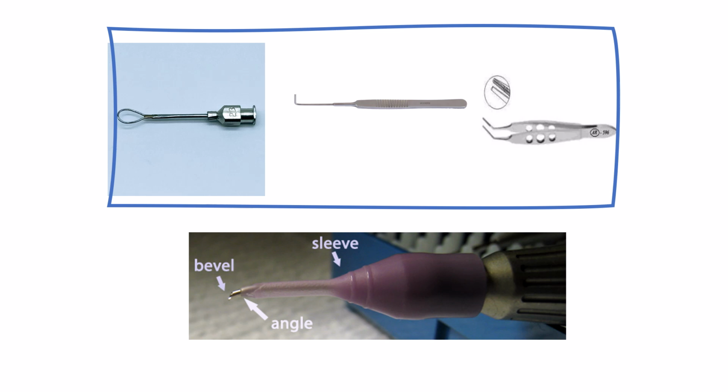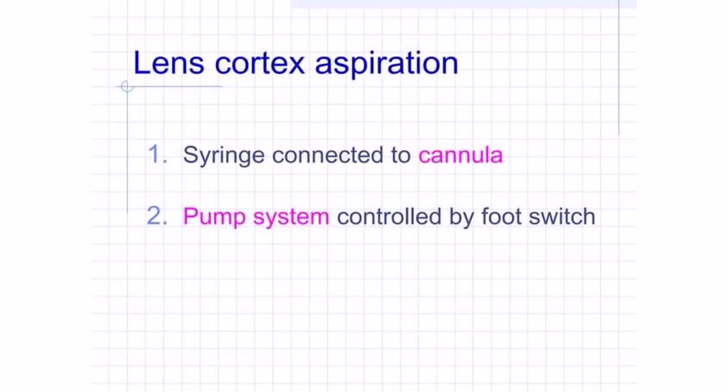And this, you see, is the phaco probe. This is the tip which vibrates and provides the ultrasonic energy used to break the nucleus. And this is the sleeve, around which water flows out. There is continuous irrigation and it helps to cool.